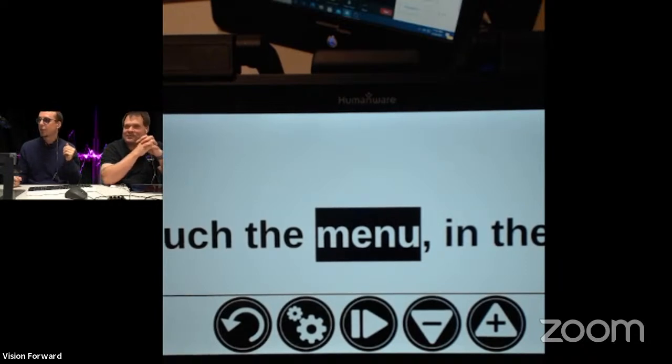And Anne says that the Connect 12 has 3 user modes: basic, intermediate, and advanced, which changes the icons and things that are available. That's very true. That's a good point too, depending on the level of your student, what they're capable of and comfortable with. That's a great tip, and you would do that in the settings. Yep. Let's back out of here.